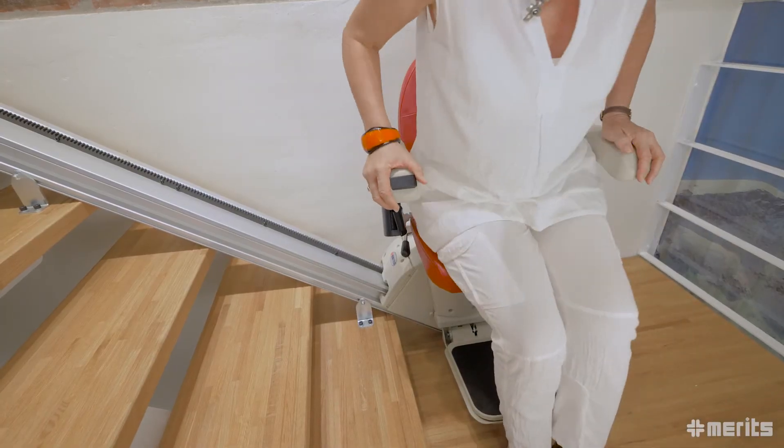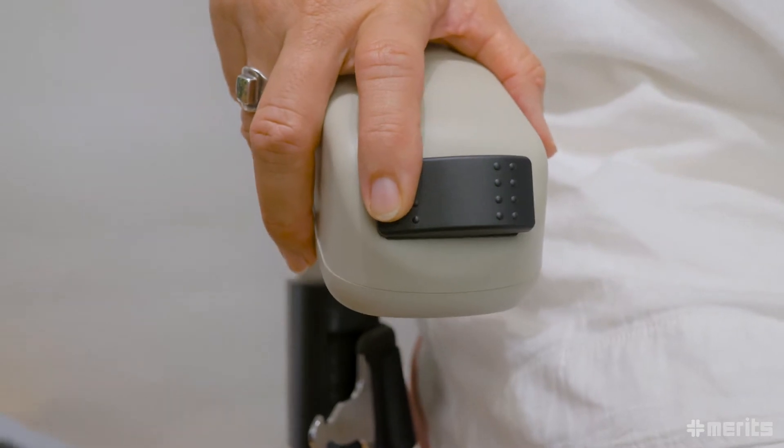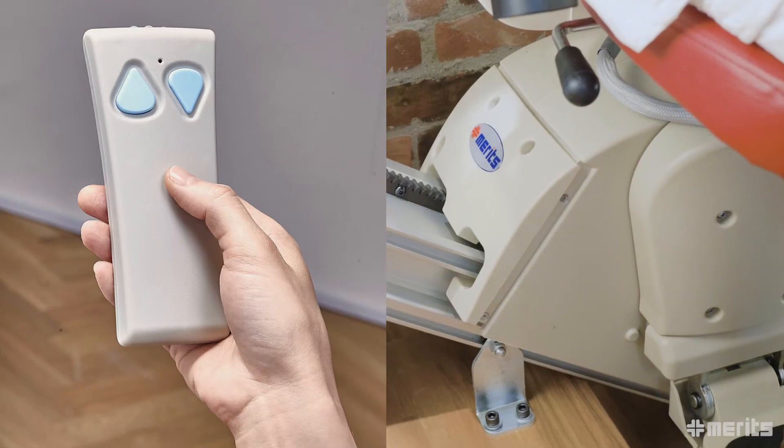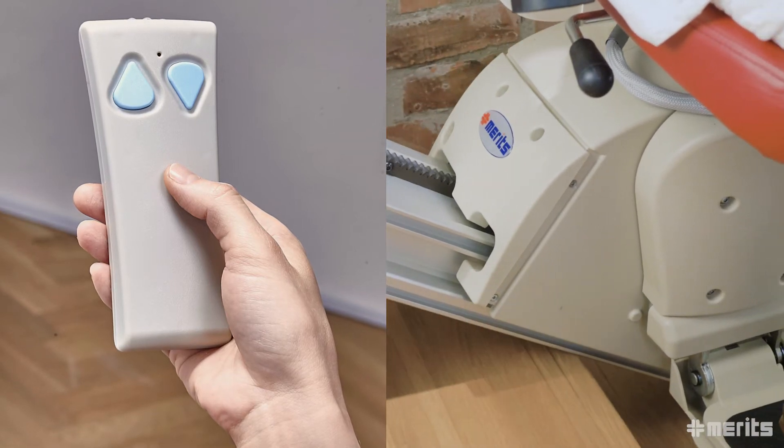The user easily controls the stair lift through the buttons on the armrest. Furthermore, the E603 also comes with an infrared remote control allowing the user to easily call and park the carriage.